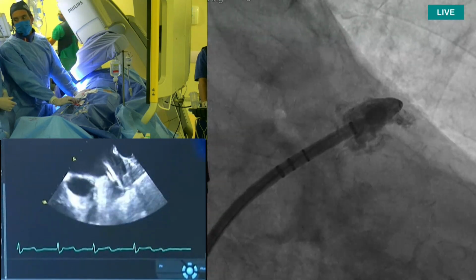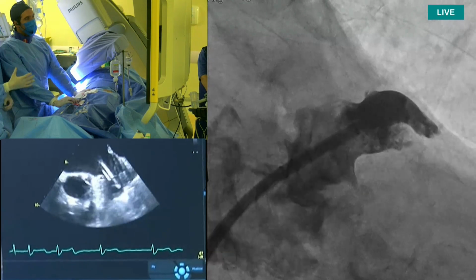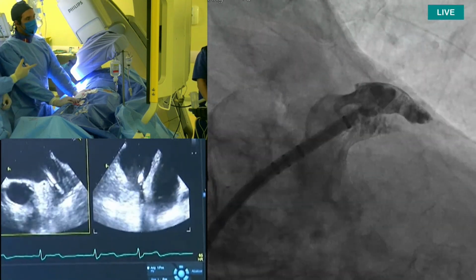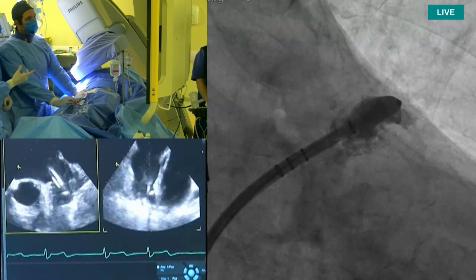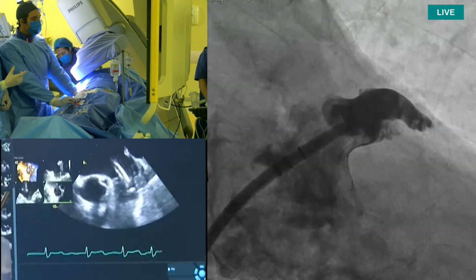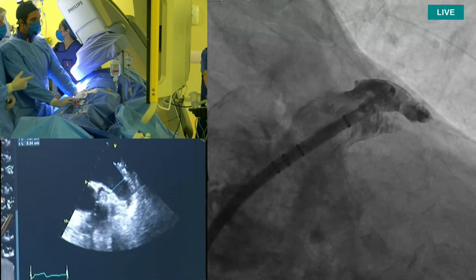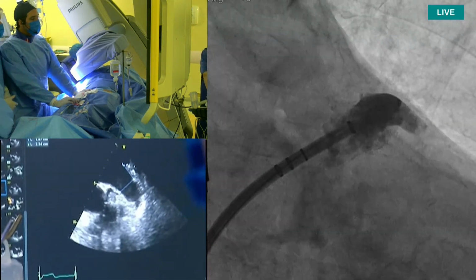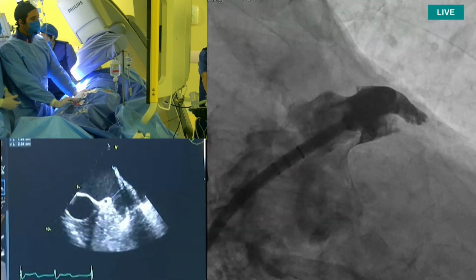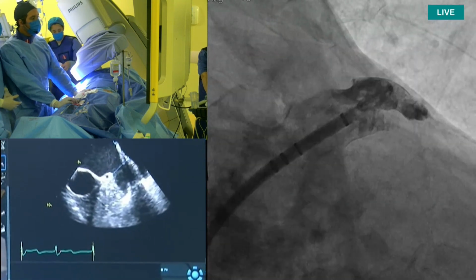What do you usually do, Oli? Do you use it? I use it just as a visual check that it's in line with the measurements on CT and TEE. Maybe we can ask the echocardiographer to show the measurements she made, so the audience can see. Before we started the case, she did some quick measurements here. She doesn't have a mic, so maybe Felipe, you can comment on what you see. This is at 0 degrees. She measured 22. We can go now to 45, and the highest diameter that we have is 20 millimeters.